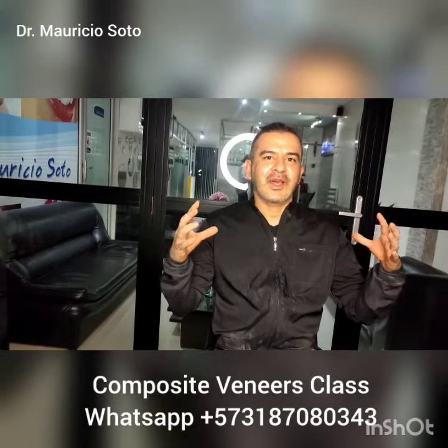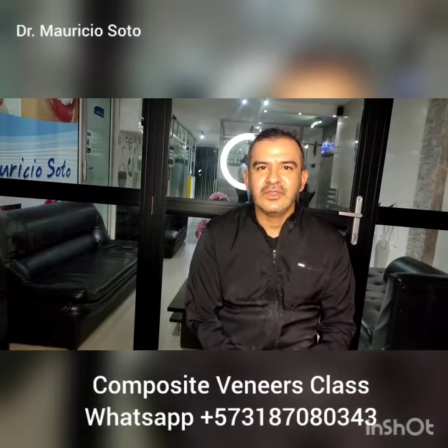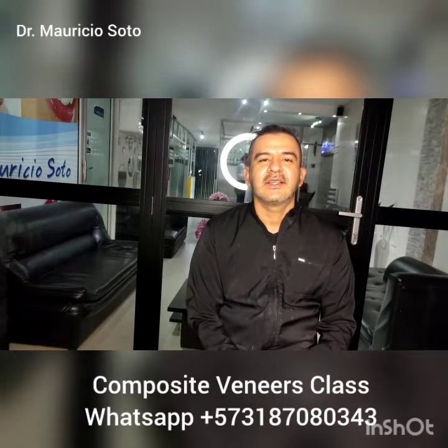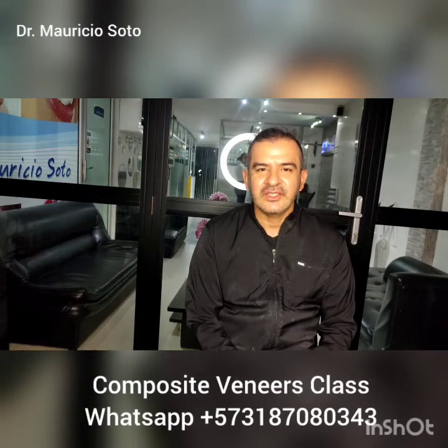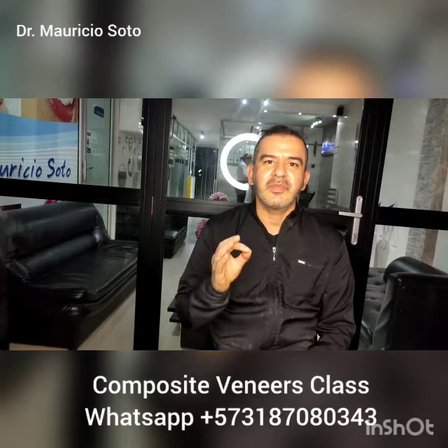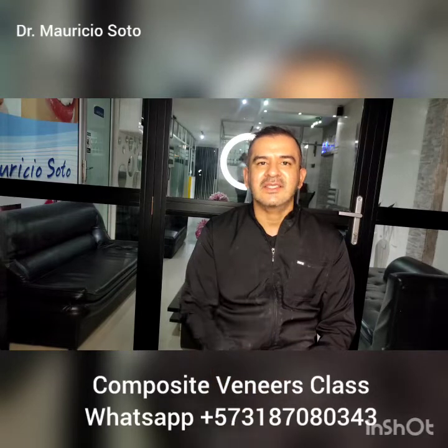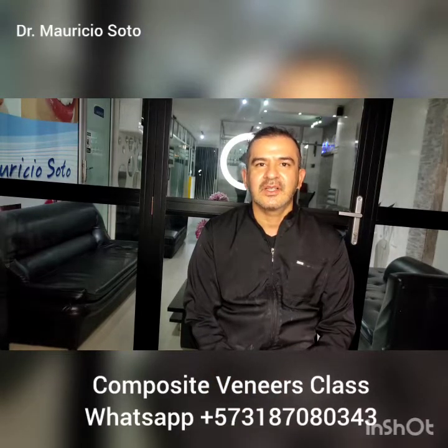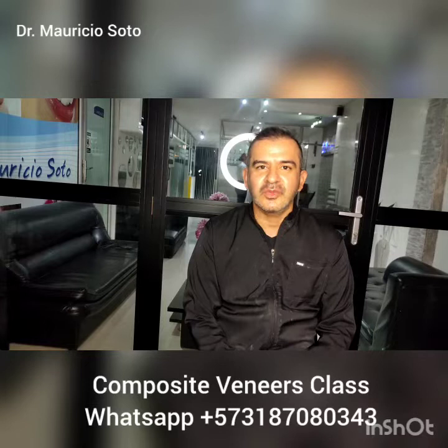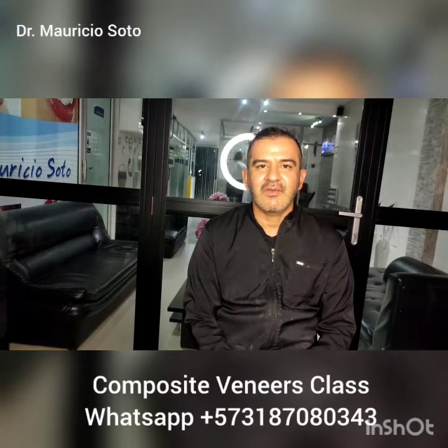After finding the right size for the veneers, I like to remove excess of composite near to the gum. Remember, the adaptation of the composite near to the gum should be perfect. Don't let any excess of composite around the gum, because this promotes the formation of inflammation in the gums — promotes gingivitis. Avoid excess of composite near to the gum.